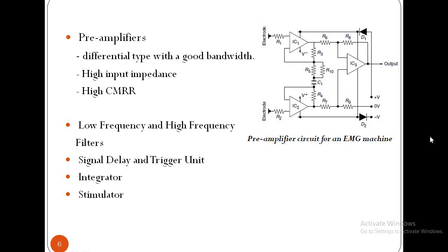The stimulators incorporated in the EMG machines are used for providing a single or double pulse or train of pulses. Stimulus amplitude, duration, repetition and delay are all adjustable and facilities are provided for external triggering also.